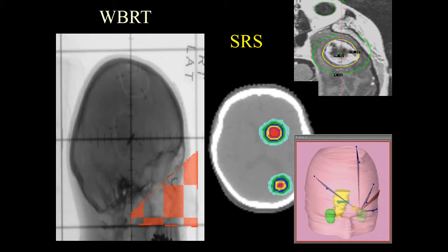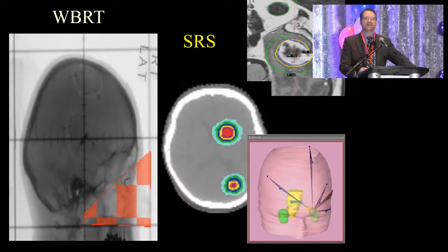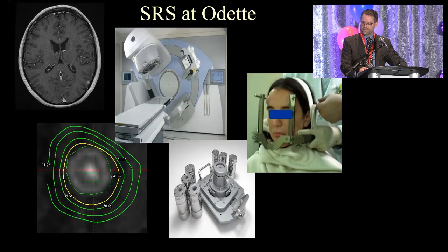When you look over the history of intracranial radiation, it started with whole brain radiotherapy. And this was the workhorse treatment for 30, 40, 50 years. And it is still highly appropriate today in selected patients. However, with the development of radiosurgery technique, we can deliver focal doses to a much higher degree. So you get the benefit of dose escalation to the tumors, but more importantly, you're protecting the normal brain from the negative effects of radiation.